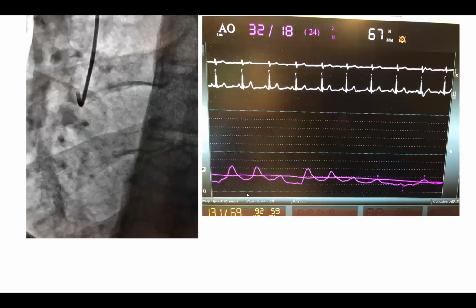Now, if you inject while in the conus, you didn't recognize this, you didn't pay attention, you inject and you see the conus and the dye staining in it, you don't have VFib yet, your immediate reflex is to just pull out that catheter and let that dye clear before you get VFib.